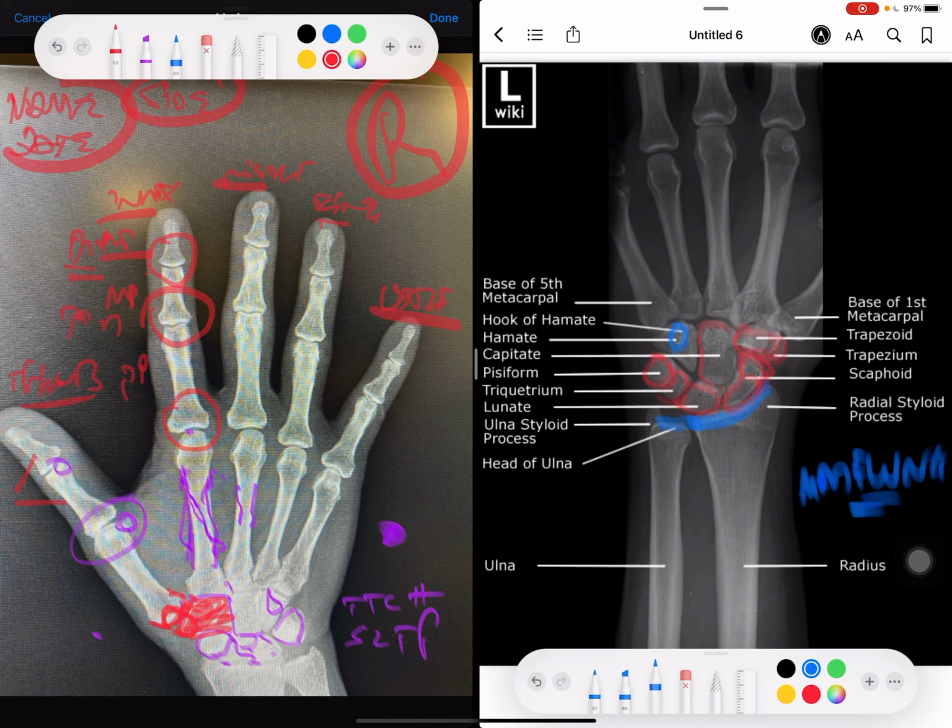And it gives you a space, it spaced it out. If you made it properly, the ball wouldn't jump out. But if people made the ball too big, then the ball would want to fall out and dislocate. If you make it just right and tight, the ball sits like that, and it's a really cool procedure.